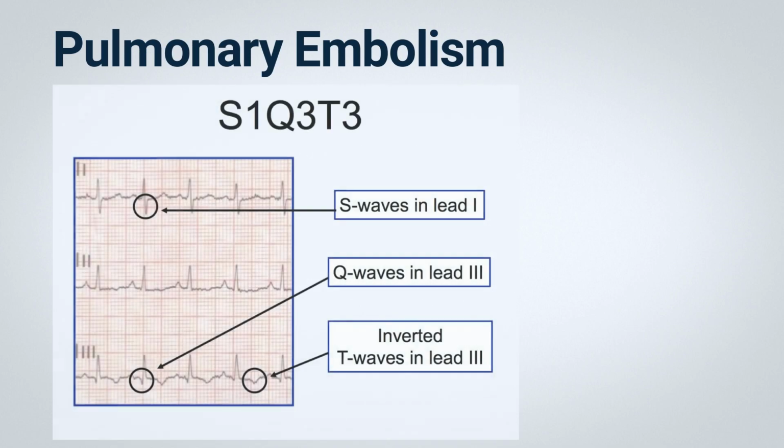The electrocardiogram is not a highly sensitive tool for diagnosing pulmonary embolism. In certain cases, an embolus obstructing the pulmonary artery system may lead to noticeable changes in ECG readings, but there is no single, always diagnostic pattern. Various patterns may emerge, including sinus tachycardia, along with arrhythmias such as ventricular ectopy and atrial fibrillation. A right ventricular overload pattern, previously referred to as strain, characterized by inverted T waves in leads V1 to V4.